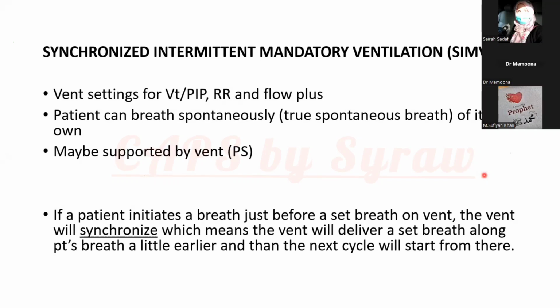In this, if a patient is initiating a breath just before a set breath is being delivered by the vent, the vent will synchronize with it, which means the vent will deliver a set breath along with the patient's breath a little earlier, and then the next cycle will start from there. So there is no overlapping, there is no fighting between the vent and the patient.